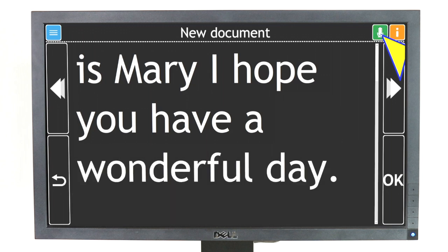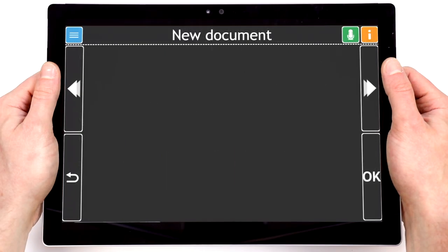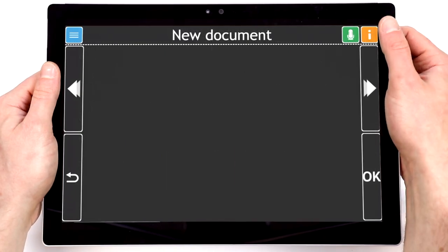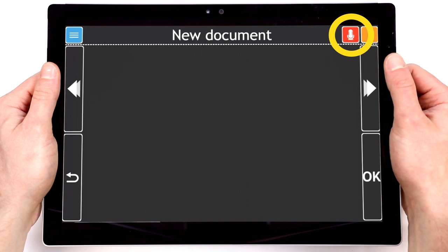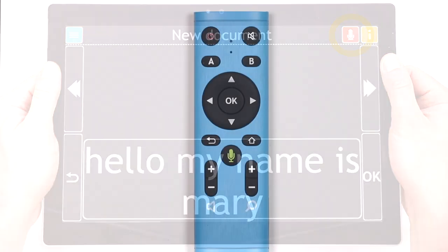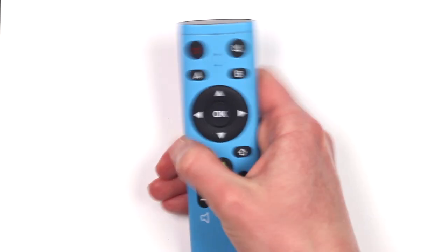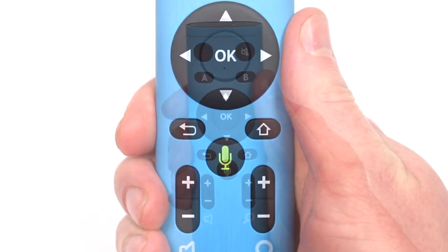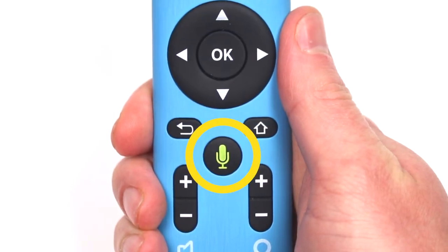You can also use the arrow keys to go through the text and change letters and spellings with your keyboard. You can also use Voice Input on a touch screen by tapping the Voice Input button near the top right of the screen. Alternatively, you can use Voice Input with the Dolphin remote by pressing and holding the Voice Input button below the circular pad.